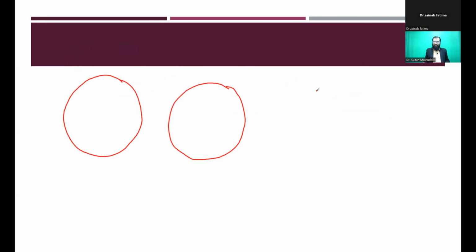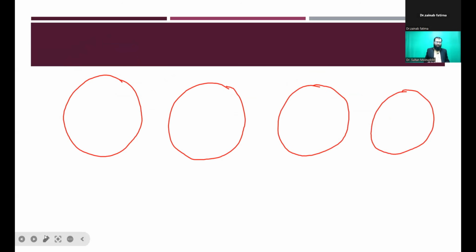Now, depending upon the stage of hemorrhage, the appearance of a hemorrhagic cyst could change. Imagine this as a cyst. Suppose this is the cyst. I'll show you the various stages of the cyst. So you'll have to follow it with me, what I'm showing you here. I'll use a different color. Acute hemorrhage. What would you be seeing?